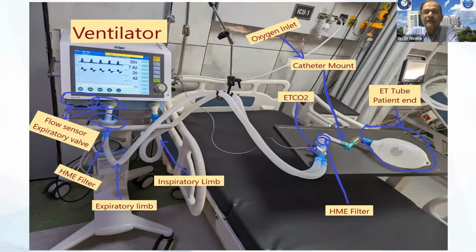So don't buy a ventilator just like you buy on Amazon, where you look at the picture and read some specification and buy it. Have them give you a demo. See that you are comfortable with it. Your staff is comfortable with it. They will promise you the earth when they want to sell you a machine, but make sure, ask others what sort of service backup they give you, what sort of parts, how expensive the parts are.